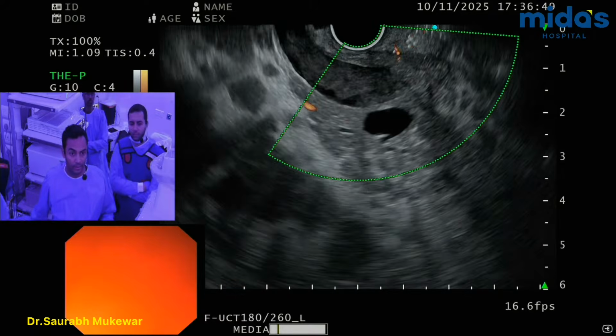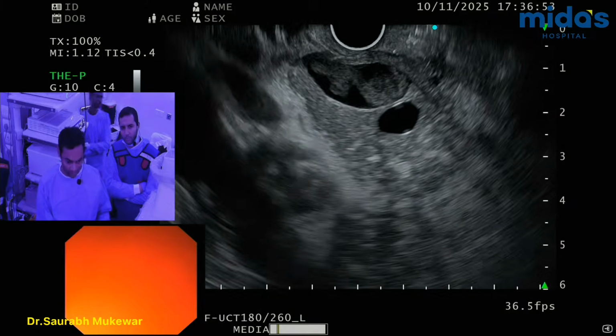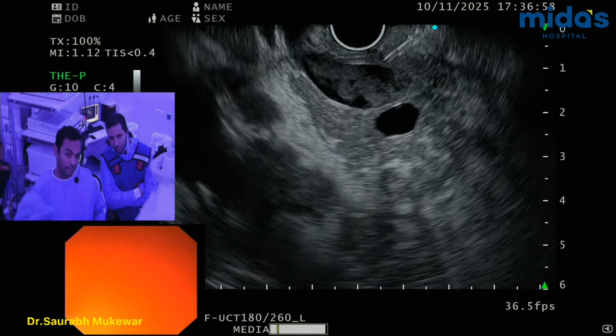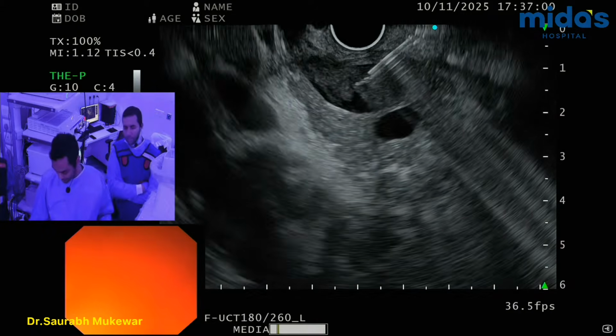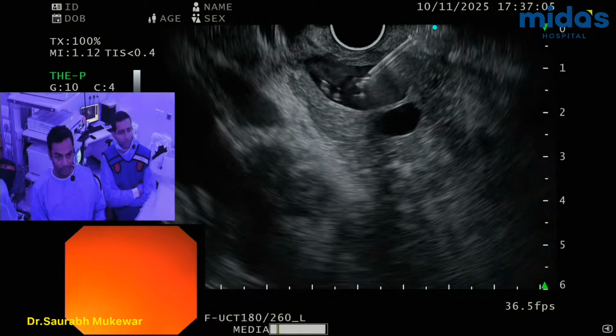Aspirate now. Or actually, no, wait. First, let me get some contrast ready. I'll need contrast in this case. See, that's not a good angle actually for CDS, but I'm going more by my EUS view. Okay, ready? Yeah, contrast. Yeah, fluoro. Live.